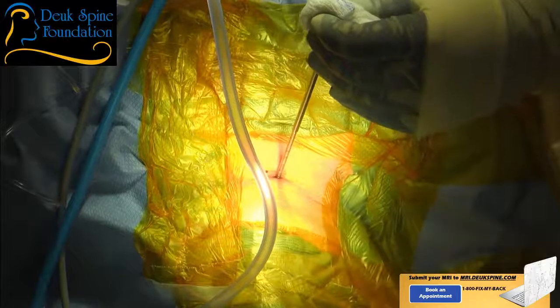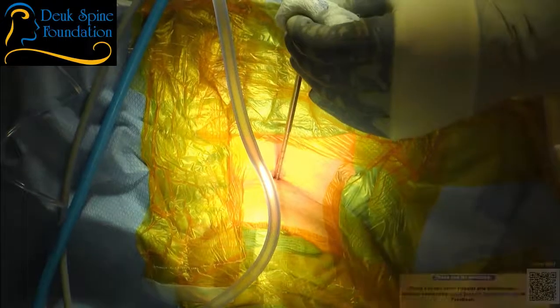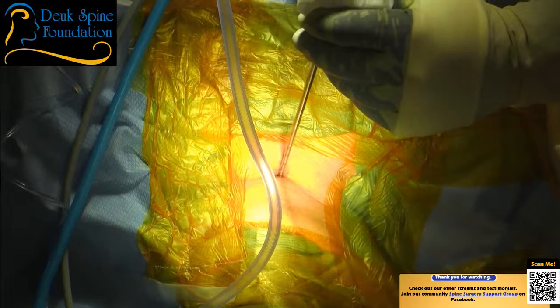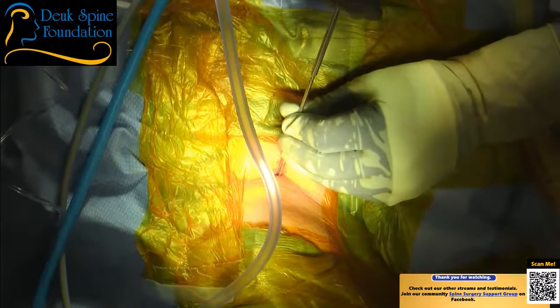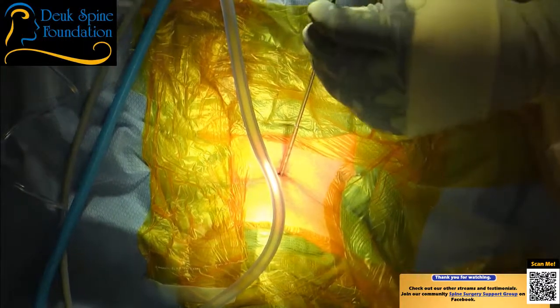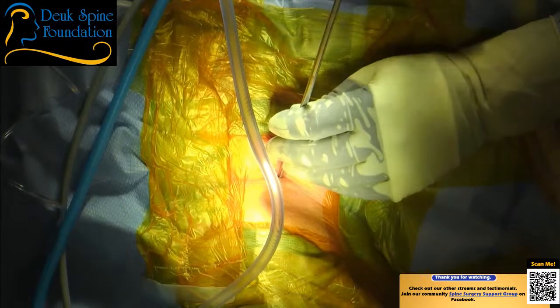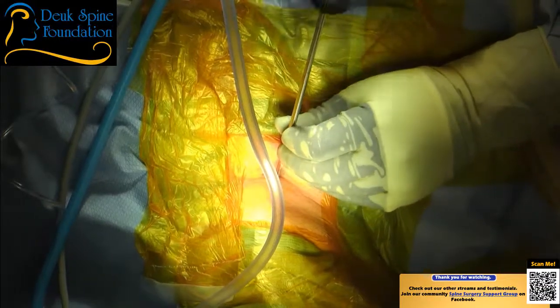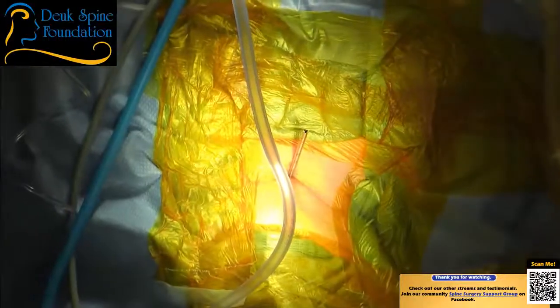All right, so we're going to keep a close eye on the dilator as we bring the tube through the disc. Now this part, basically going through the disc, is called transdiscal, and it basically means we're just going through the disc to get to the back part. So I got to be careful. Because again, the dilator is on the move. That's something you have to always be aware of. Don't worry about that. I can feel it moving. The only thing I cannot tell for sure is the dilator moving, which is inside of it. And you don't want the dilator going in and hitting the spinal cord, because that will paralyze the patient. So that's not our goal today.